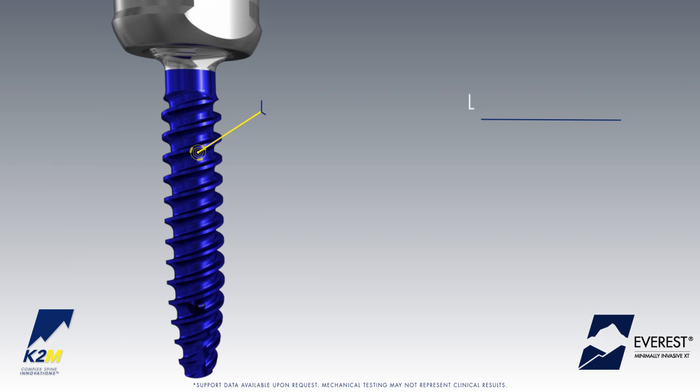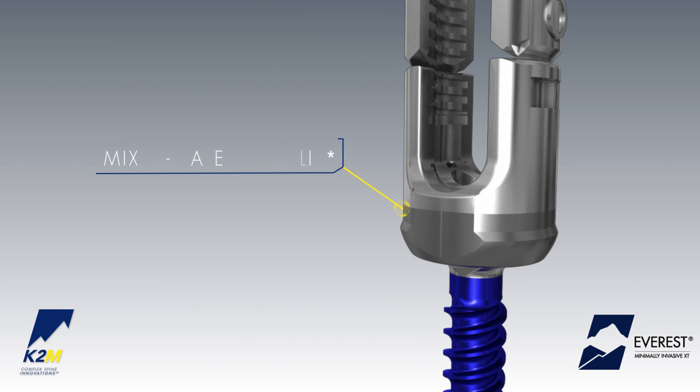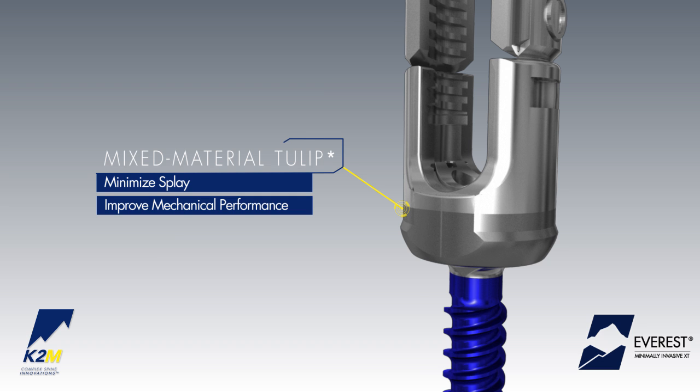These features and benefits include an enhanced dual-lead thread pattern, allowing for quick insertion and demonstrated pull-out strength, and a mixed material tulip designed to minimize splay in the tulip head and improve mechanical performance.